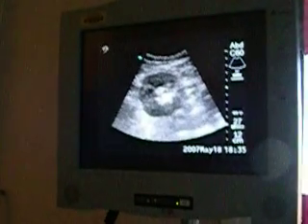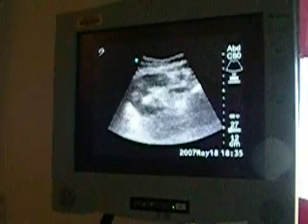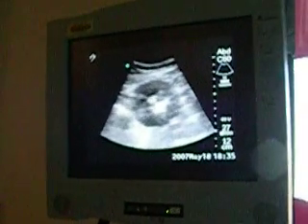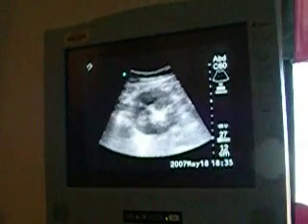The middle of the kidney. So if it were — like I remember seeing the sonogram of my other kidney — it would have crystal parts around it if it had a problem, right? It would have a little reflective — it gets really white. Your kidney looks good.